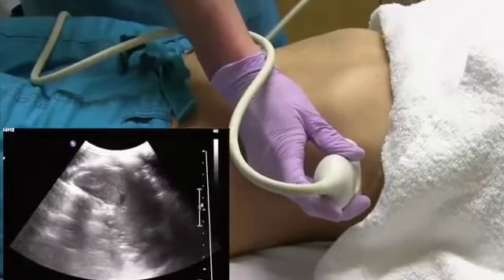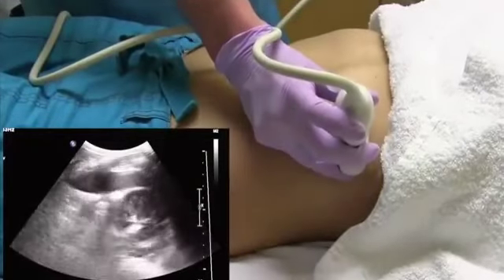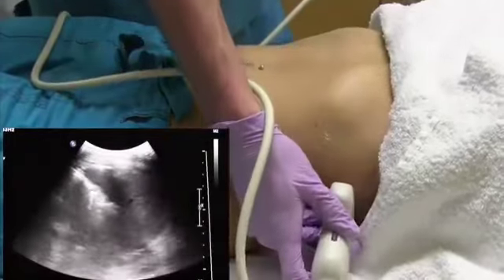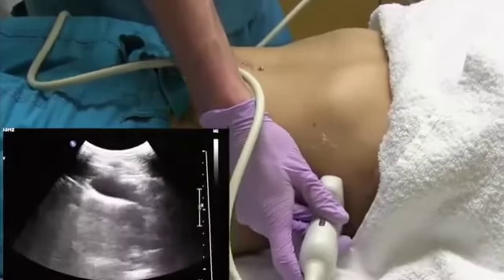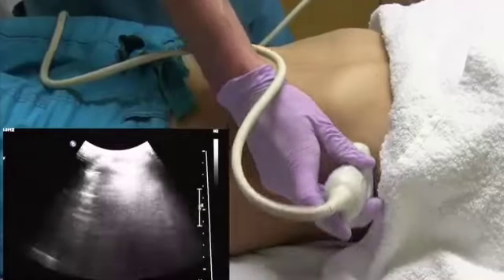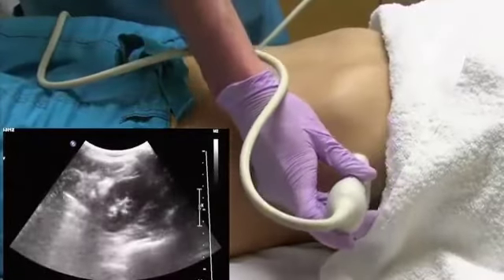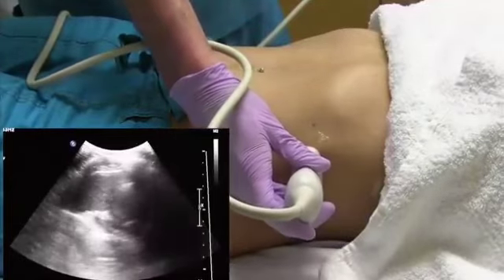But all you can do is just angle, maybe come a little more anterior or posterior to get around those ribs, and just sweep through as much of the spleen from these different windows as possible until you feel like you've seen the entire spleen.